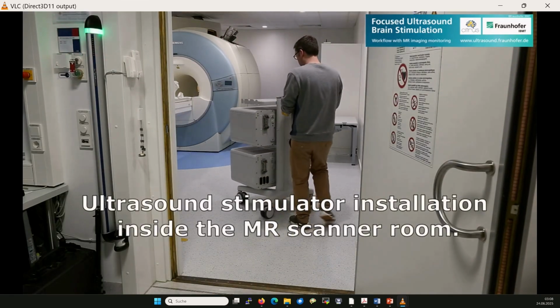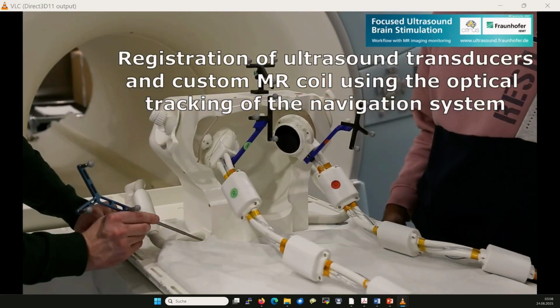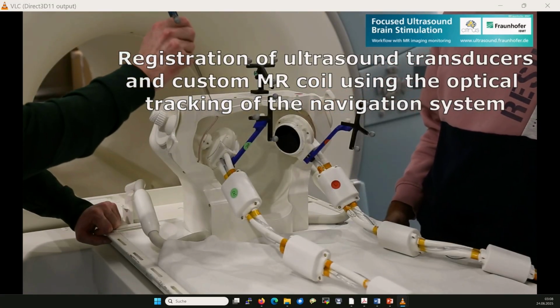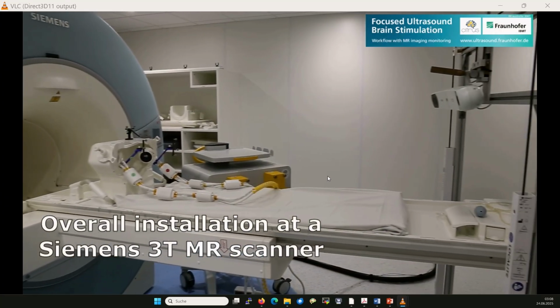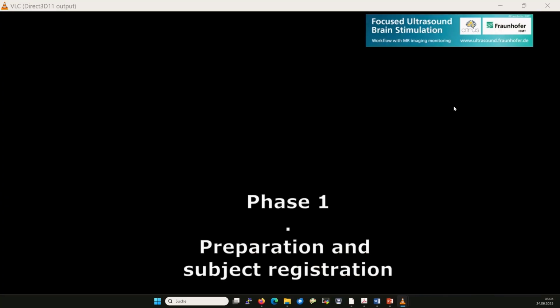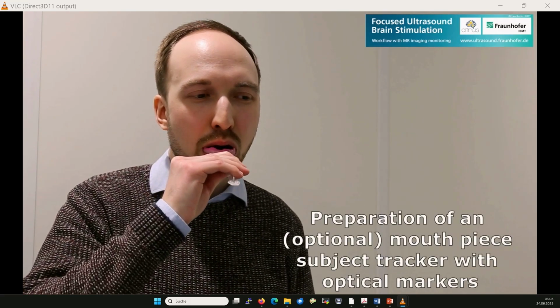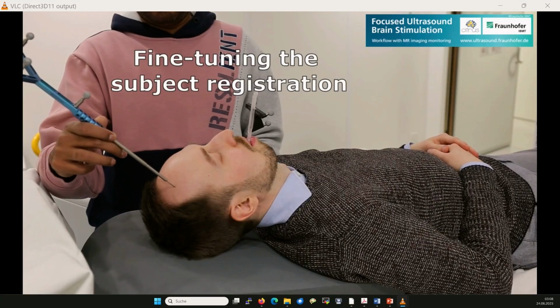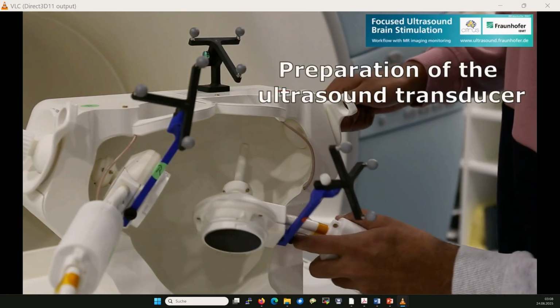Right, so I'm going to skip that. This is just putting the stuff there. So this is the setup. This is the registration of the system with respect to the neuronavigation. Here you have the neuronavigation camera. This is the brave subject with a mouth tracker. And this is how this subject is then being registered.